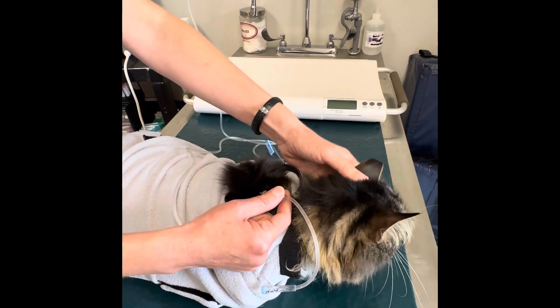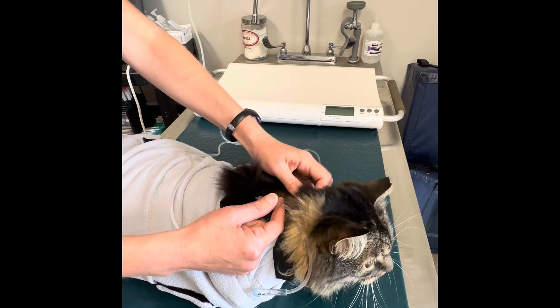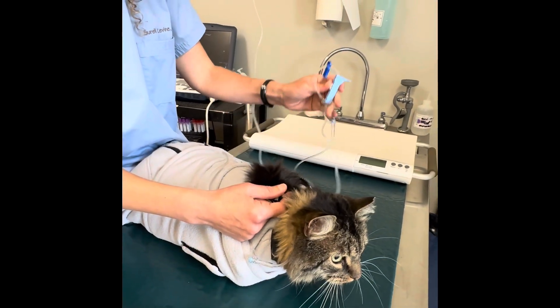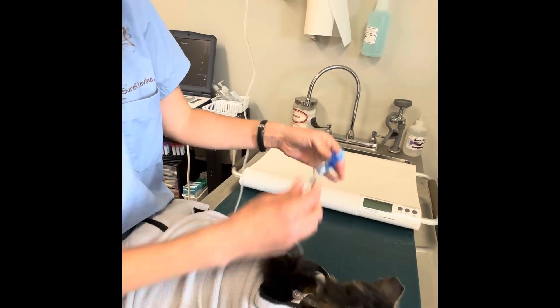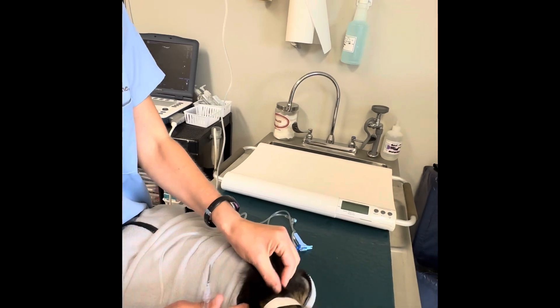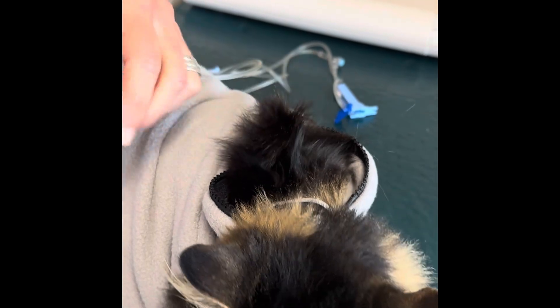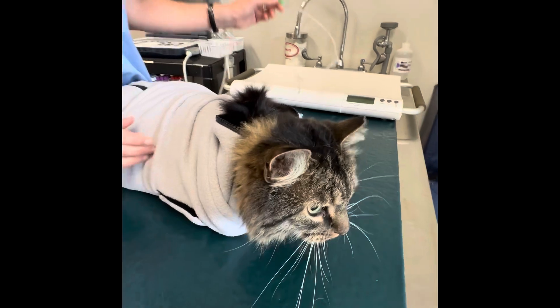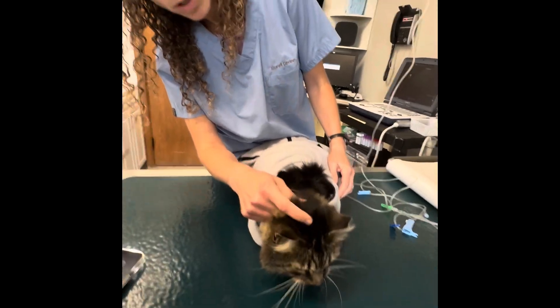I always just keep a hand on this, but he really can't go anywhere, and I can just try to settle him in for this. When I'm done, I'll kink it and pull the needle directly out. Usually I'll apply a little pressure where that hole was just so it doesn't leak out too much. And then he's done — I'll use a fresh needle the next time. You do great, my handsome boy.